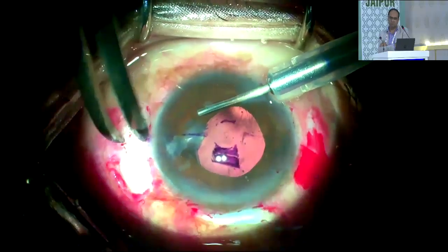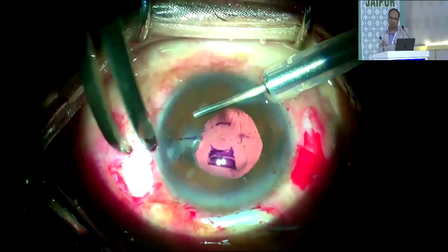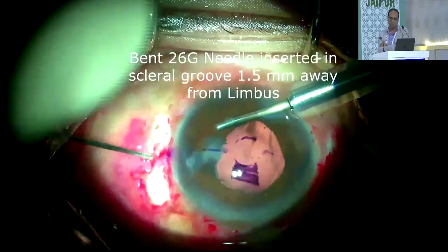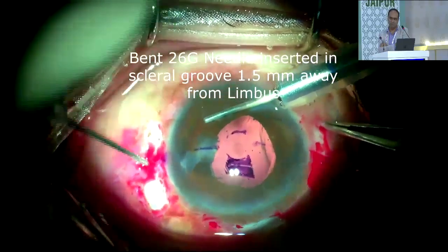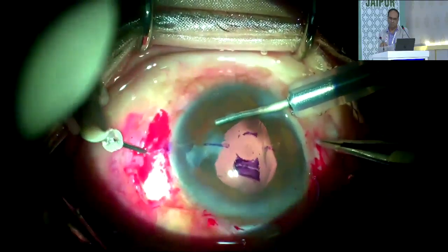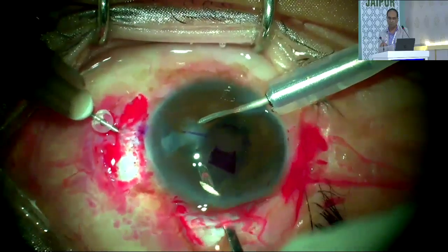Then a 1.5 mm measurement is taken on a caliper and marked at the 3 o'clock position on the sclera. Then a 26 gauge needle bent at its hub is inserted 1.5 mm from the limbus through the left scleral groove and exteriorized through the scleral tunnel.